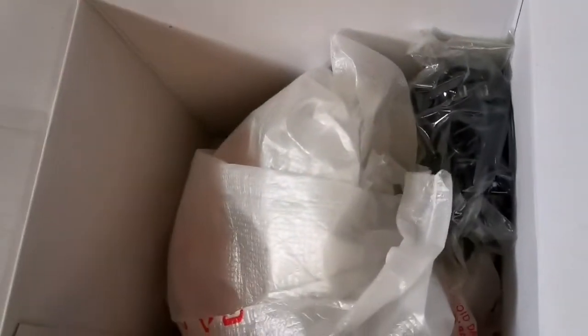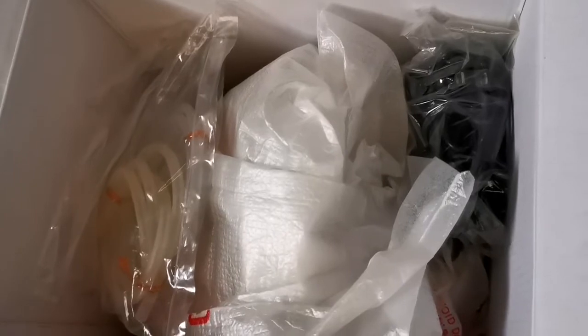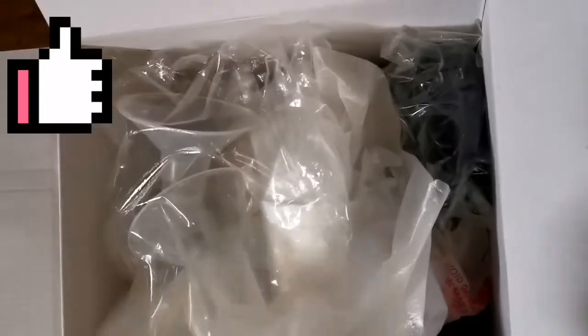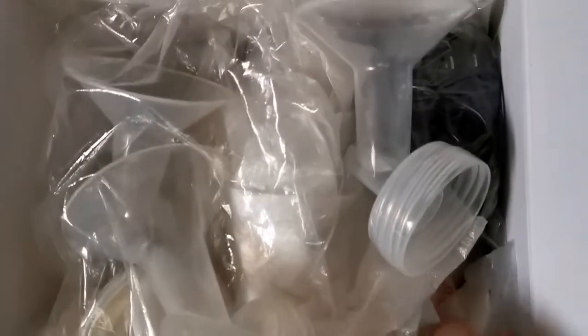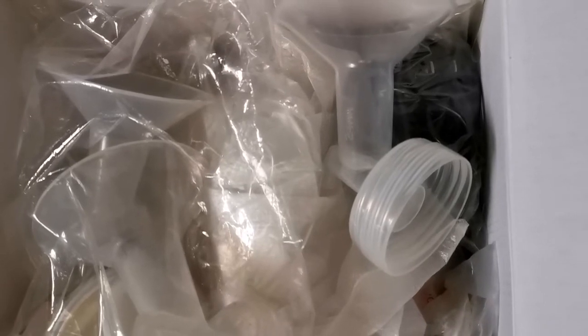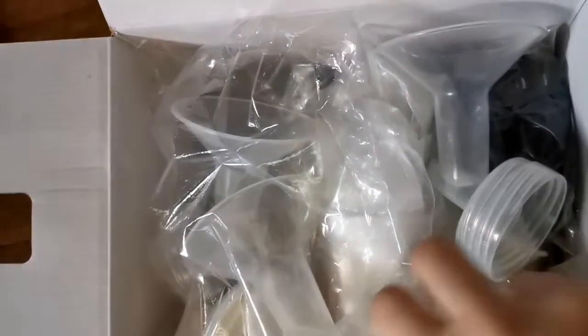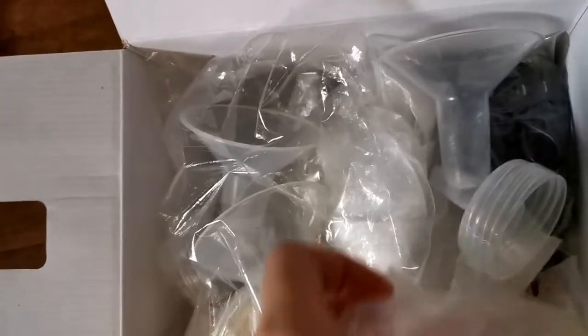If you're planning to buy a Spectra S2, this is a good pump with great reviews on Amazon, so it's a recommended breast pump. I highly recommend it because I've been using this for a long time for my third kid — about a year and a half — and it really helped during my breastfeeding journey. If your goal is to breastfeed your baby 100%, this is a very reliable, durable, and hospital-grade pump. That's it for my review — thank you so much for watching, bye!